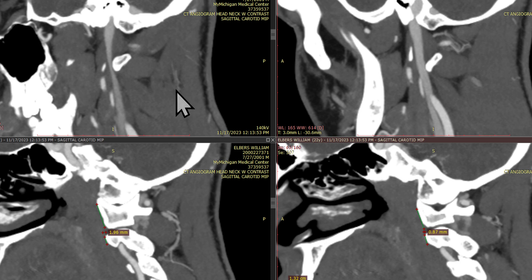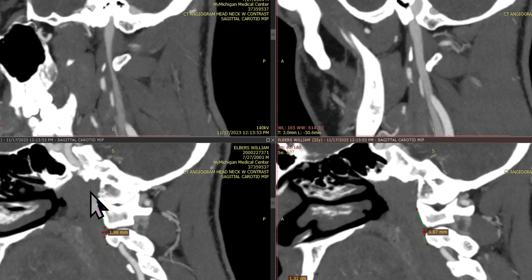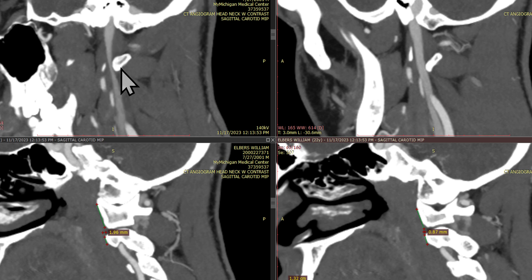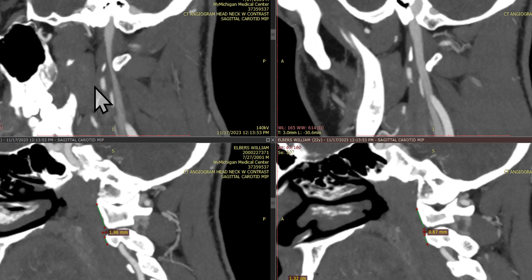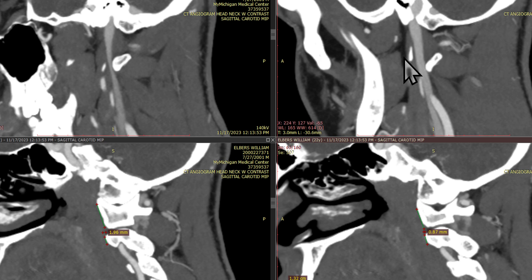We have here the internal jugular vein, and on this side, which corresponds to this image down here, we have some moderate to severe compression of the IJV. This is the transverse process of C1. This is the styloid here, which is calcified, and we're seeing some blockage of flow. You can compare that to the other side, where we see good flow.